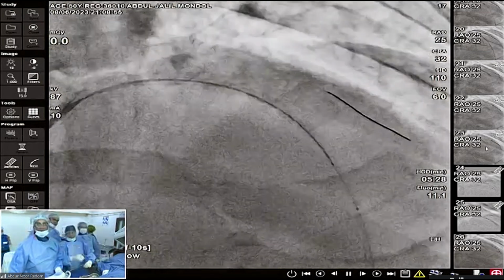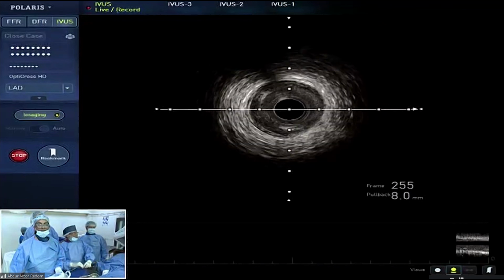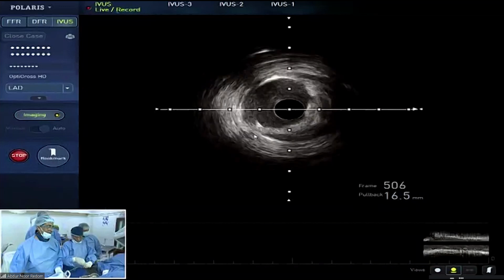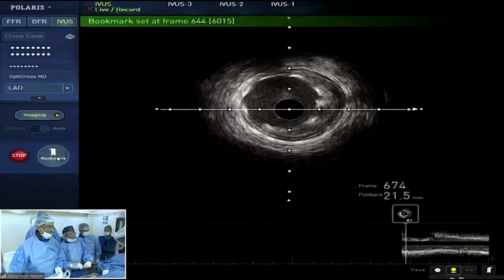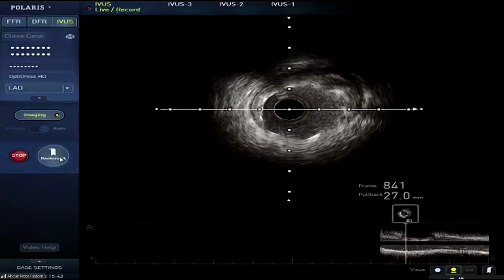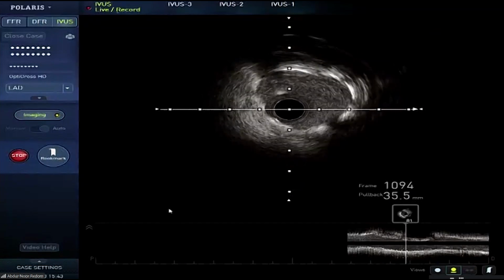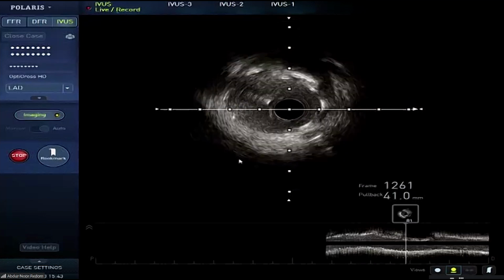You see the IVUS, pullback IVUS. Can you show the IVUS for them, please? Are you seeing? It is a high definition IVUS, which means 60 megahertz. The diagonal came, and you can see that bookmark. There is still some plaque there, but minimal. Stent apposition is very good. MSA is good. At the 12 o'clock position, there is plaque.